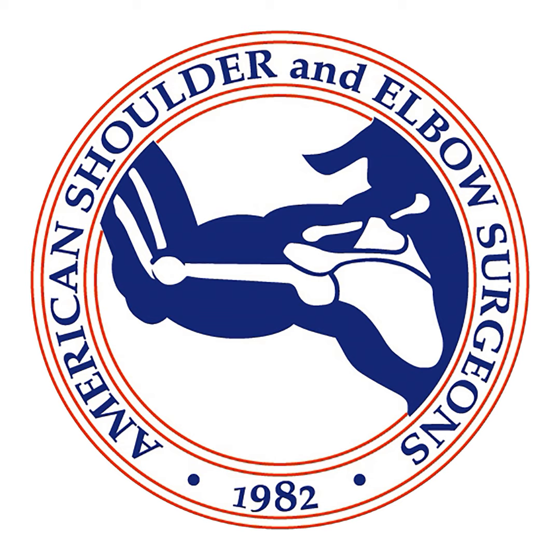It can create stress shielding. So, depending on the implant design and the sizing and the fixation, you might see resorption of the proximal humerus from stress shielding. And if it does fail for whatever reason, whether it's aseptic loosening, or simply malpositioned or infected, the revisions can become pretty complicated. You may not only be compromised in the proximal humerus region, but may have compromised bone stock well down into the shaft of the humerus, which can require some pretty heroic salvage techniques to compensate for that.